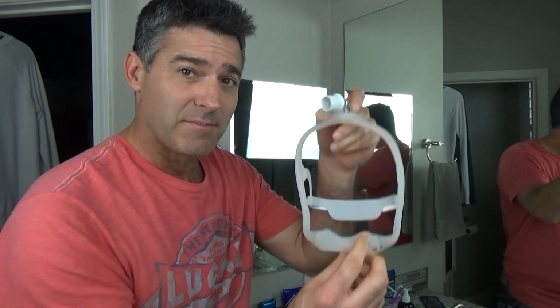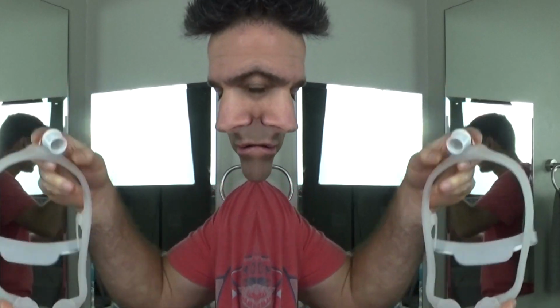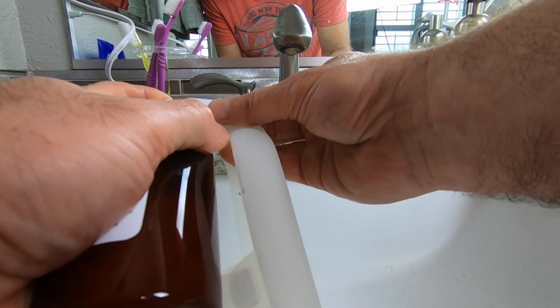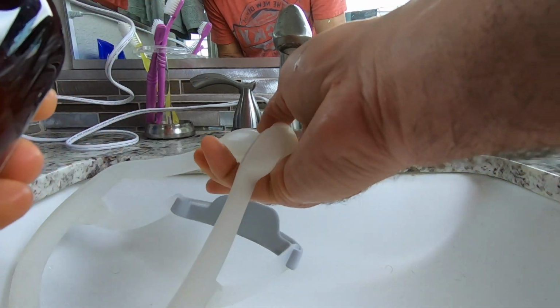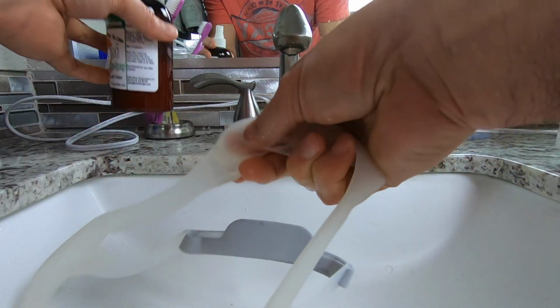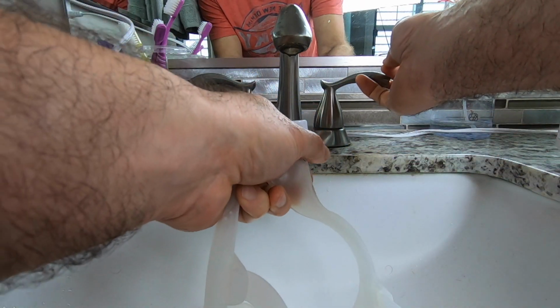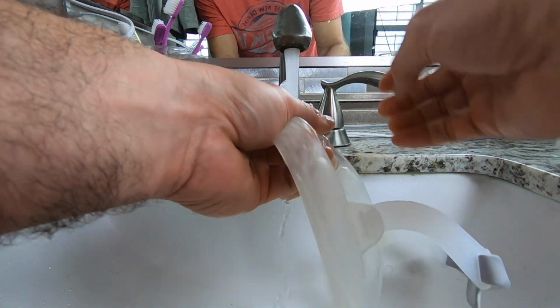But now let's do the next mask, and that is the Dreamwear under the nose cushion. Oh dear me, this looks difficult. Same kind of deal. We're just going to take the Mask Bright, since we haven't used it in a day, and we're going to spray it right in here, right in the tubing. Give it like 3 sprays. It'll kind of work down. We're also going to spray the cushion here that makes contact with our schnoz, and I'm going to agitate it. Work that around. Very nice. Now we're just going to put a little water in there and then blast it.